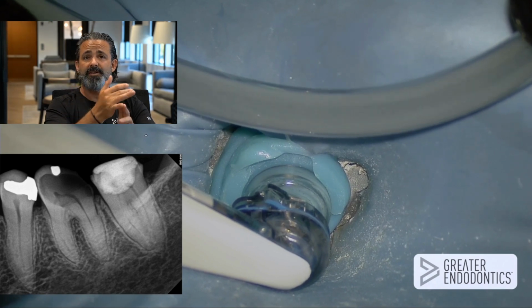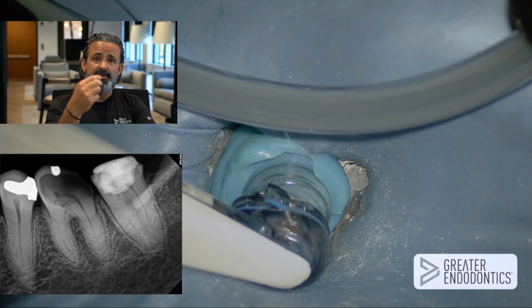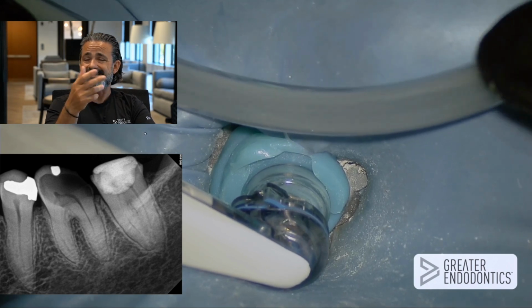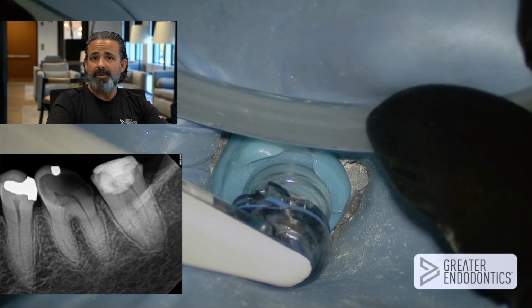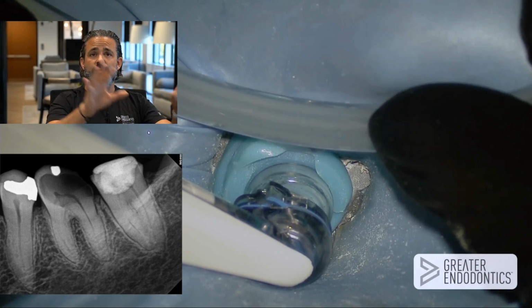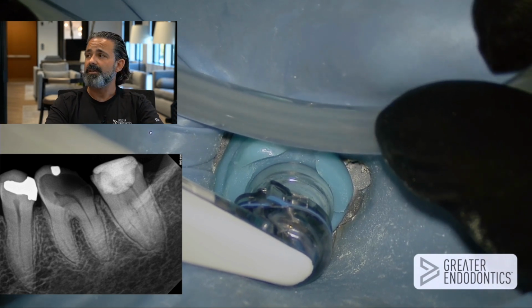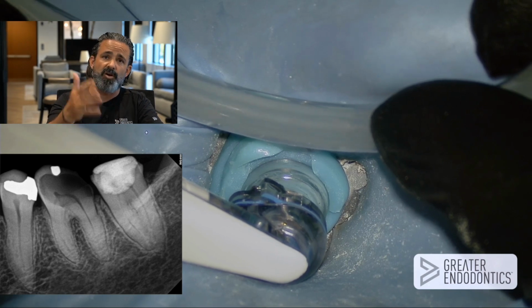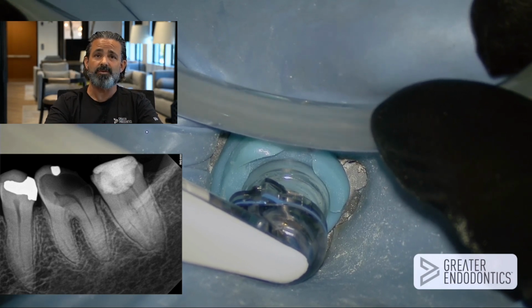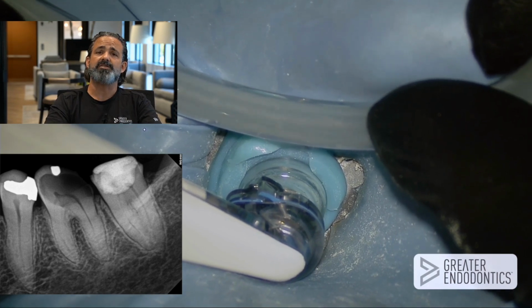You also have fluid dynamics, which are a physical force agitating pulp tissue or remnant debris, dislodging it, if you will, off the walls. And then you have the echo of the sound wave lapsing against the canal. And that's where they get their BAR, their broad spectrum acoustic resonance of the sound that's kind of going down. And it's just essentially white noise as I understand it. And that's what this thing's doing. And it's doing it to do it effectively.